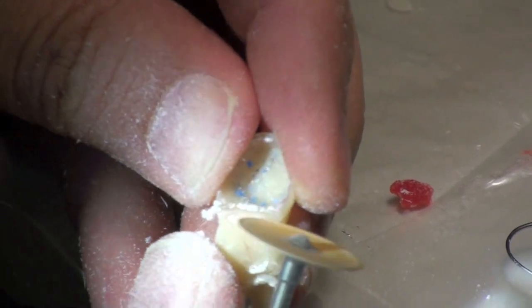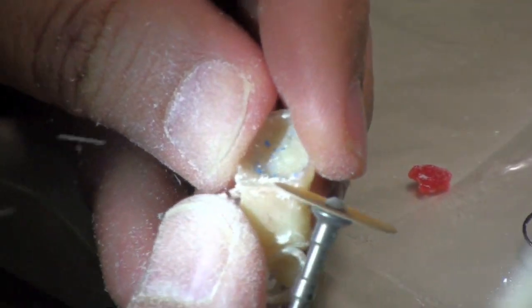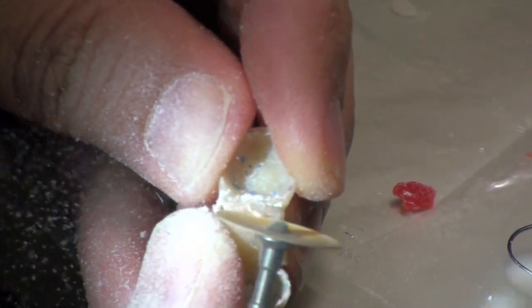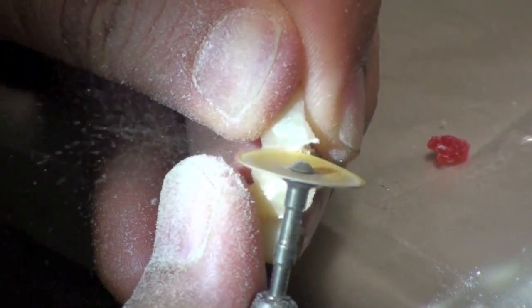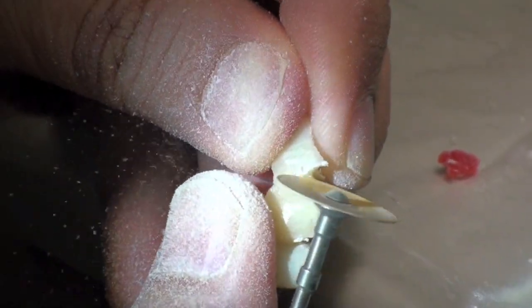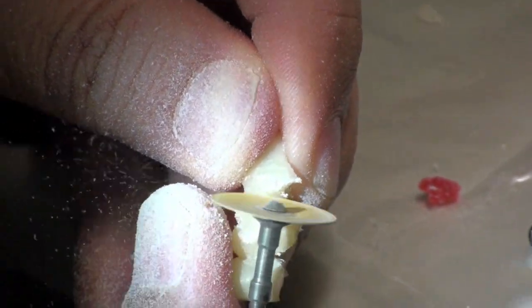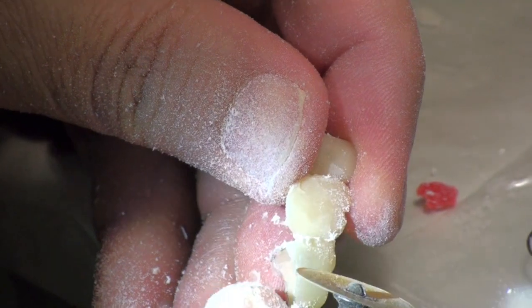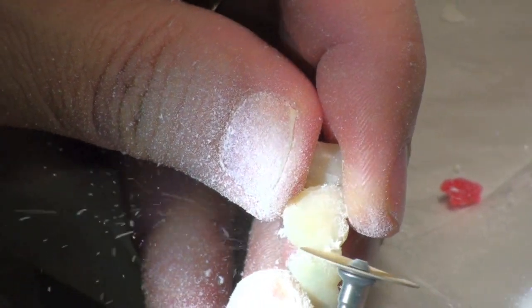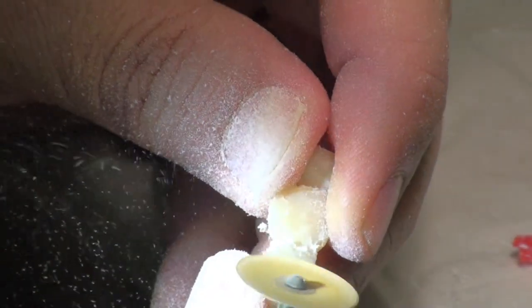You don't want to cut too far in with this — I could take this and just cut straight through it. Because the more you make this cut, the weaker the temporary becomes. So you want enough for aesthetics, like on the outside. I want this to look like a separate tooth. Notice how I'm just pulling against this thing and rounding it. I'll flip it around — that side's rounded, this is not. I'm just trying to create some individuality of the teeth as well as creating a rounded surface at my margin.